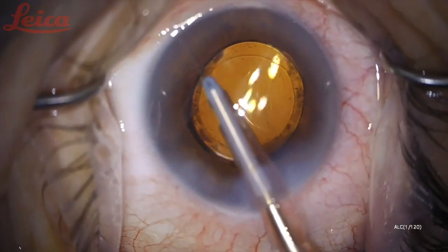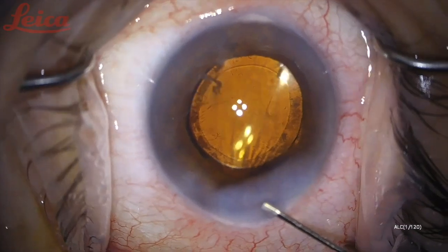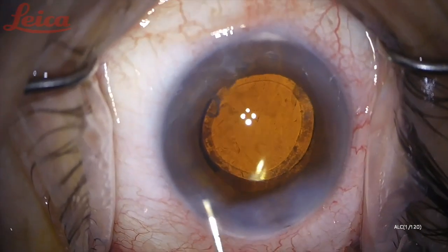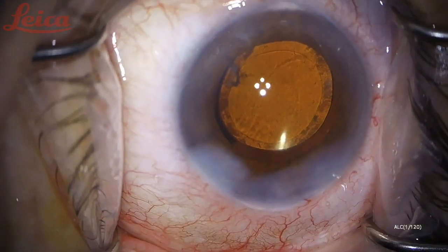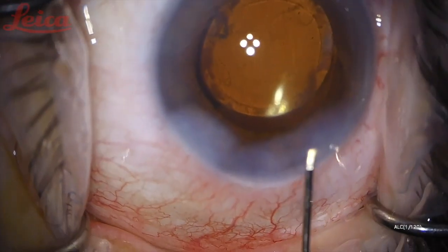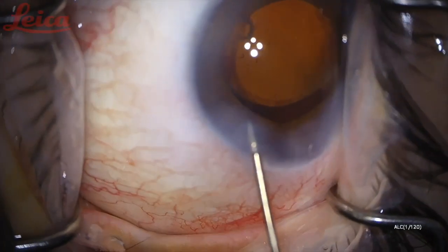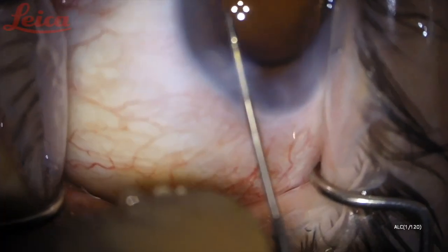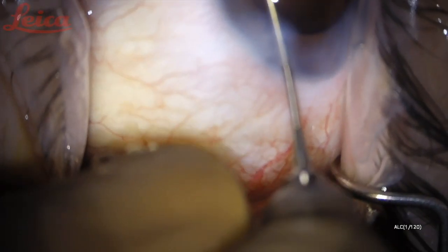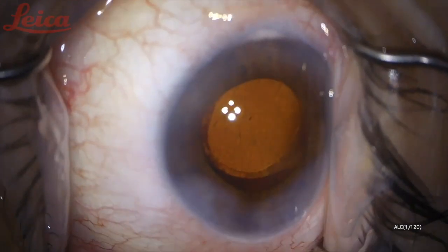Alternatively, sometimes the strip will show up at the end of the case when you're doing your IA. Sometimes it'll come loose and suck into the IA tip, sometimes it won't. So if you don't want to refill the eye with viscoelastic and use a utrata, you can hydrate your incisions and then call for a micro forceps through your side port — you should be able to grab it and pull it out without collapsing the chamber. It's also totally okay and probably safer to leave very small strips or tags alone.